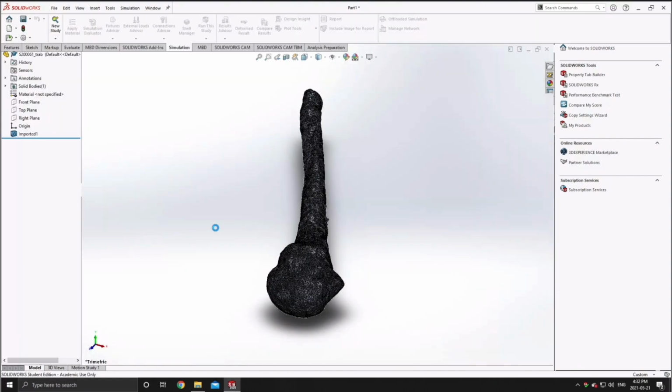Now, it's probably good to mention here that this parsing procedure, once you open up your .stl output files from Mimics, will take a decent amount of time to parse and process the 3D models into a SolidWorks part file. So you may want to use whatever computer is fastest, if there's a processing computer that's newest, to do this procedure, and then just bring over your files via USB onto a slower computer, as this does use up a lot of your memory.